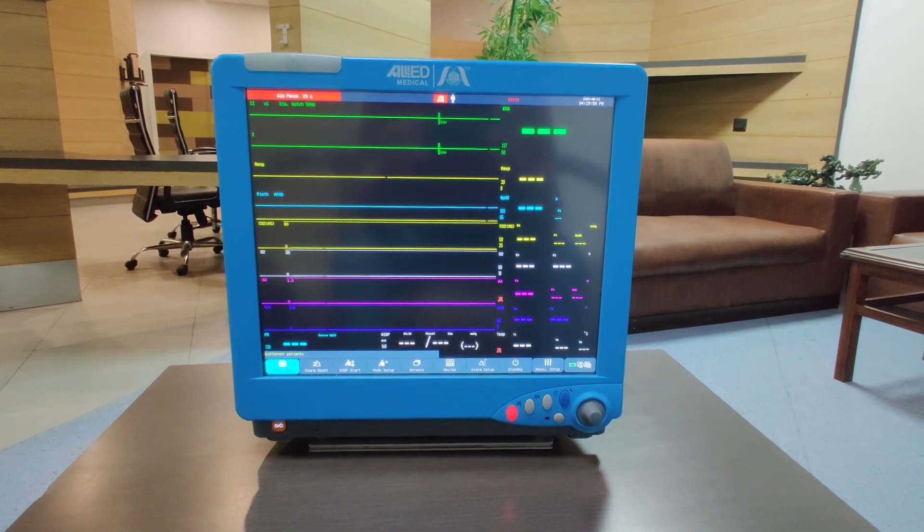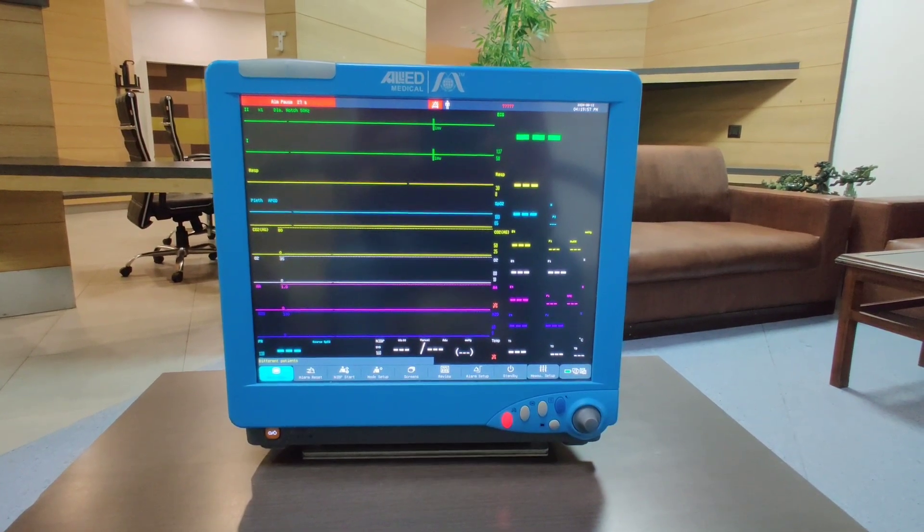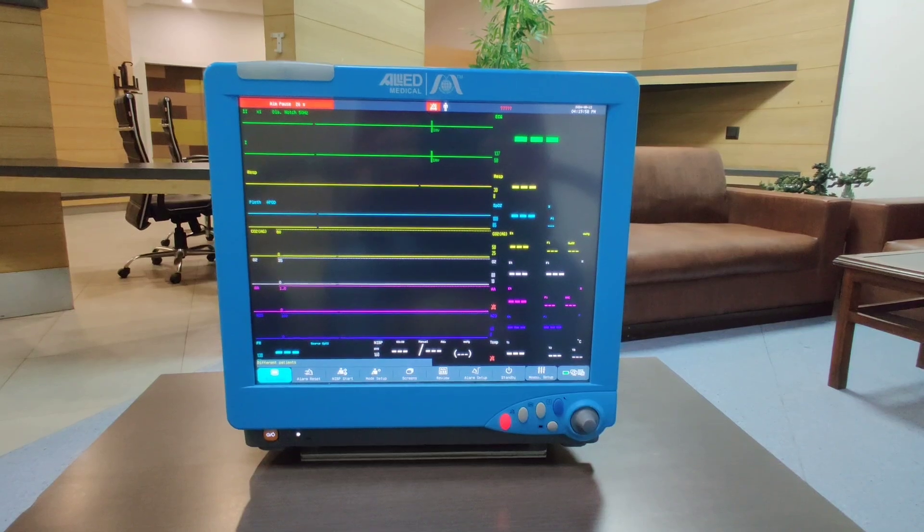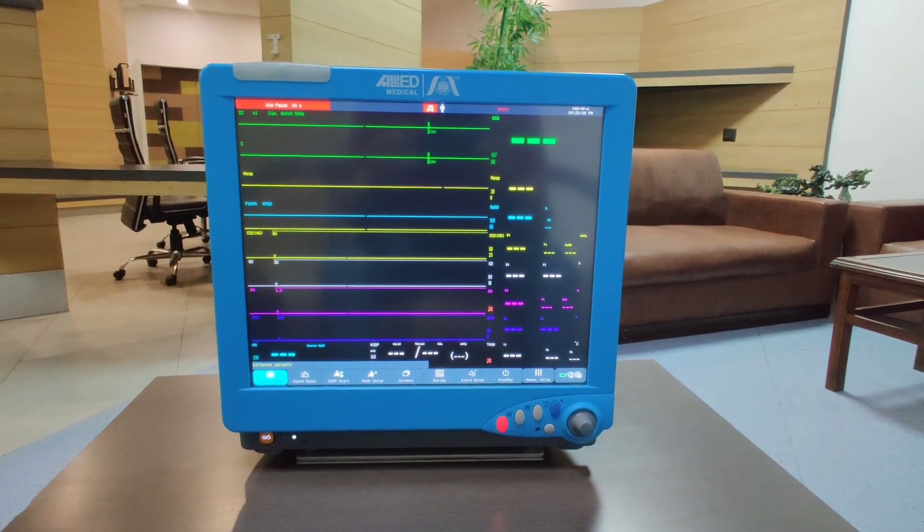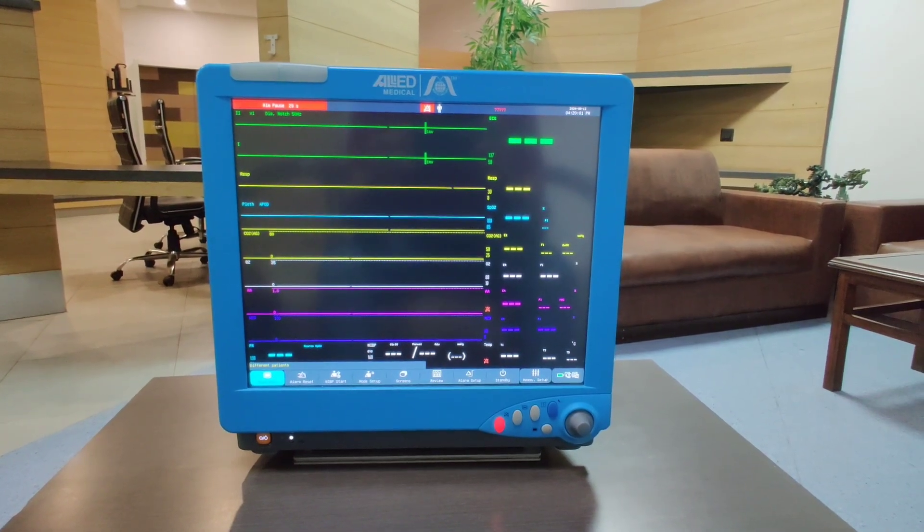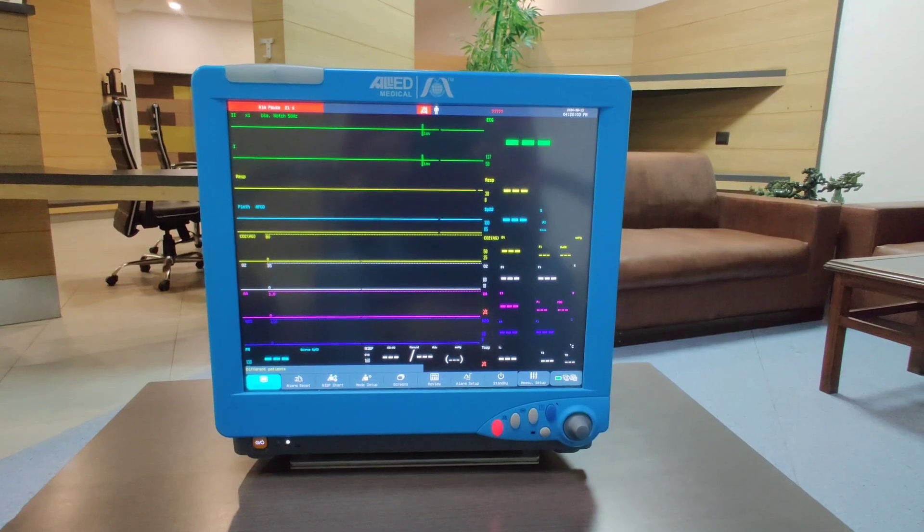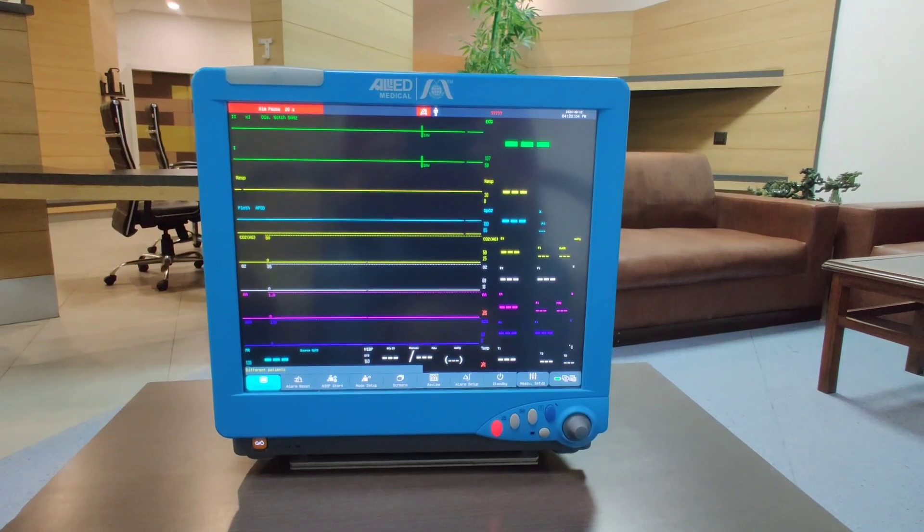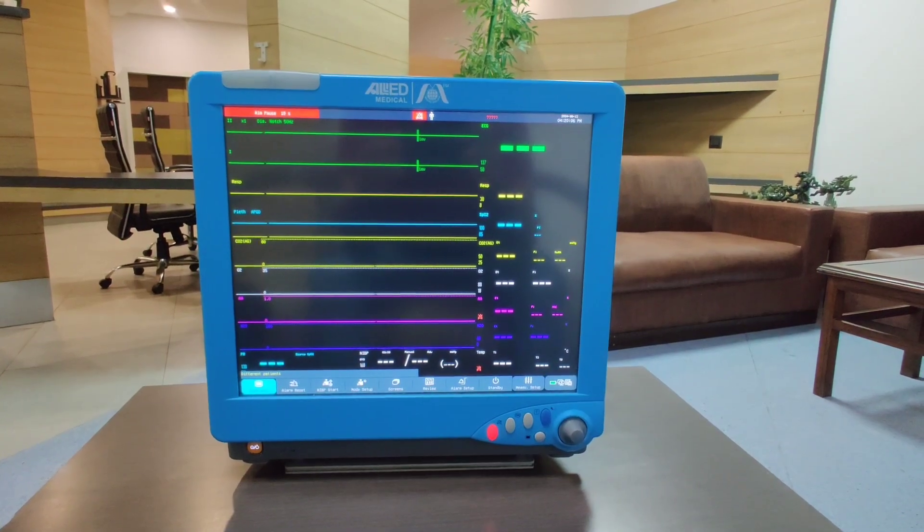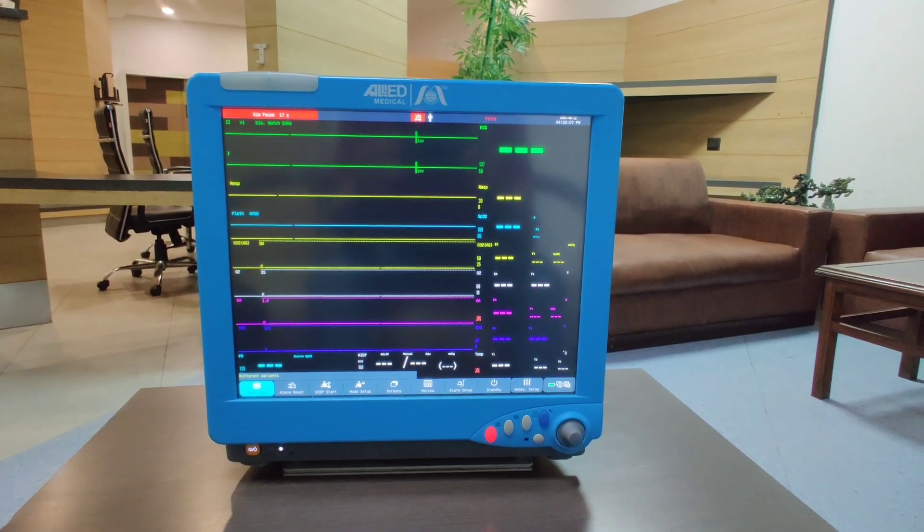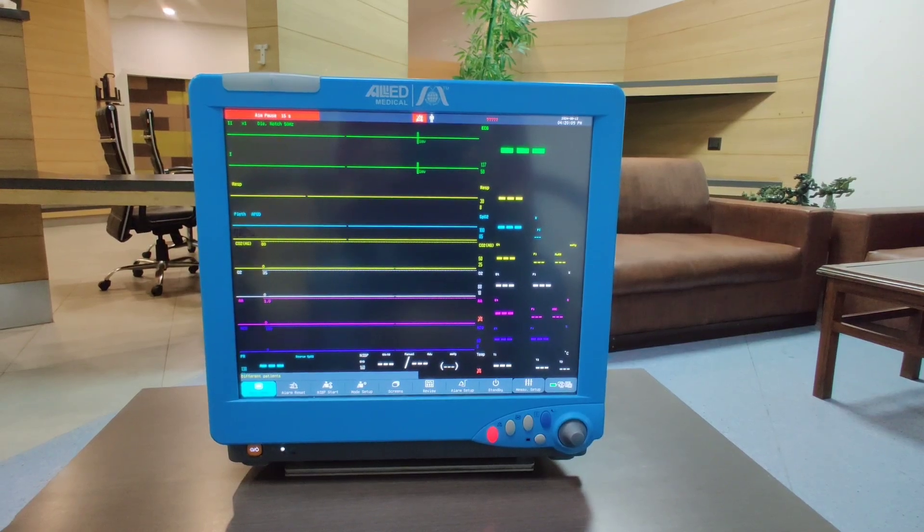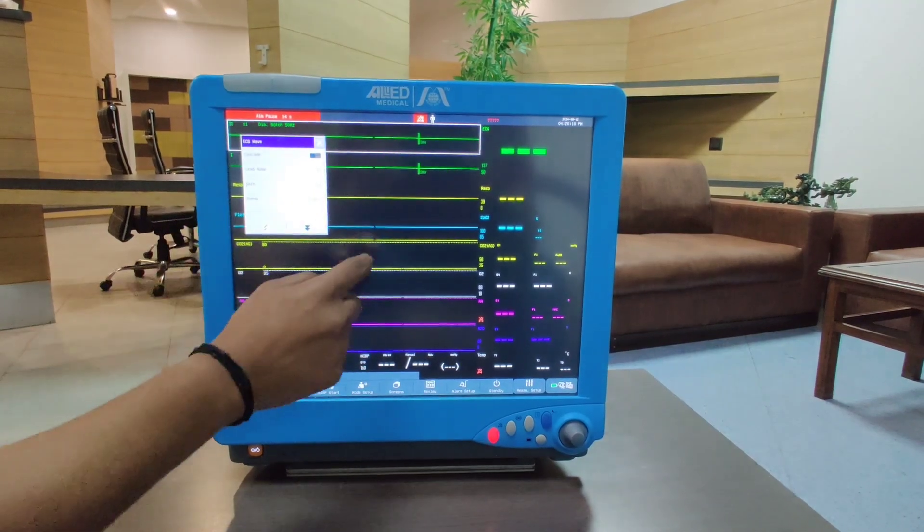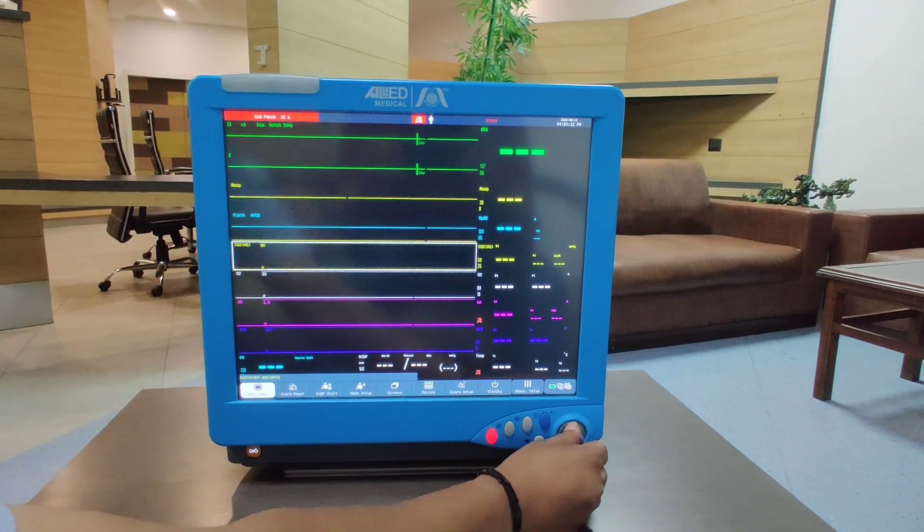Hello everyone, in this video we will be discussing the demonstration of the top end model of the patient monitor, the M797. This is a fully modular monitor with a screen size of 17 inches. We have touchscreen facility and both knob operations available.